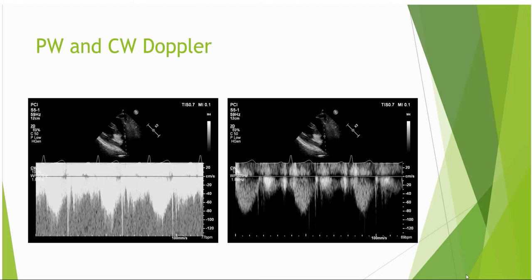And as we can see in this image here, for the overgained one, we wouldn't be able to trace a VTI because we can't even see the signal as it moves towards the baseline. And while we look at the undergained one, while we can actually see a clear, defined flow, the velocity is significantly lower.